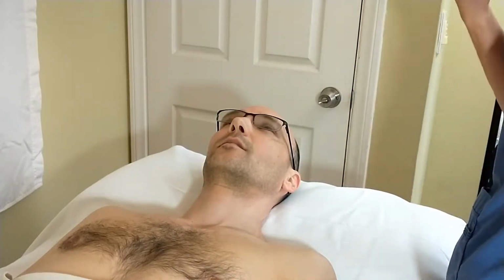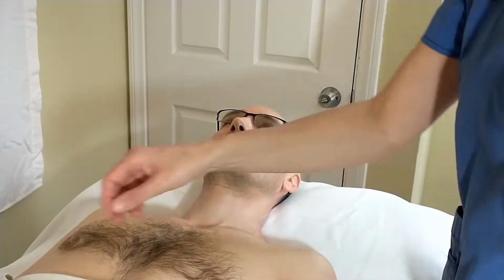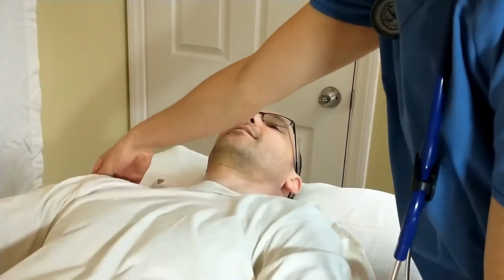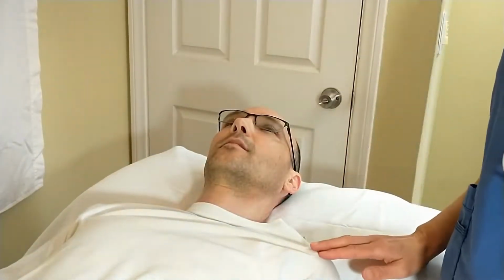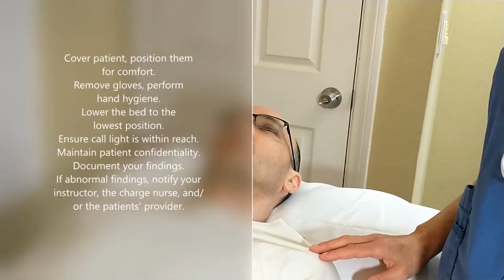After I'm done counting for a full minute, I know that this is my patient's apical heart rate, and I take care of my patient by getting them dressed. And then I am done with my assessment, and I will go ahead and record my findings.